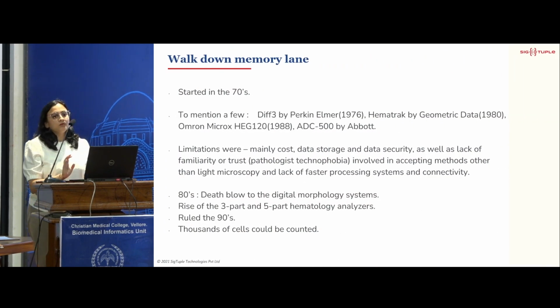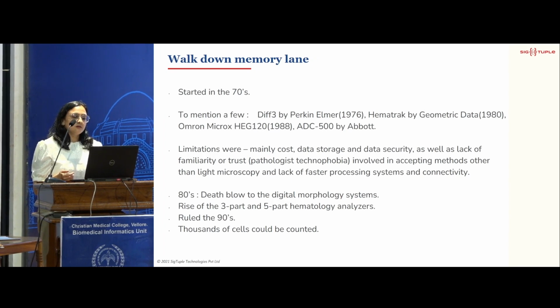Now, this digital morphology system is not new. It started way back in the 70s itself, where there were a lot of limitations due to which this did not click. The main ones were the cost, the data storage, data security. I think we've been hearing these terms since morning, right? And also there was a lack of familiarity or trust. This is one of the most important things, and we face this problem even today.